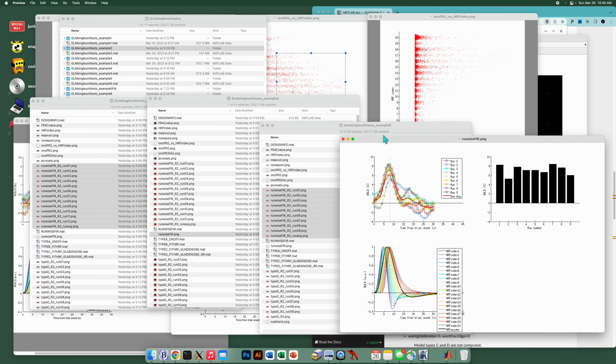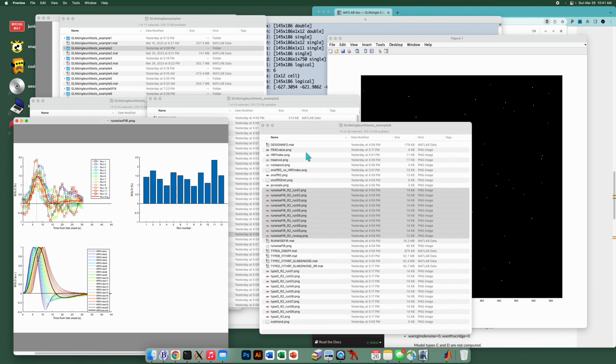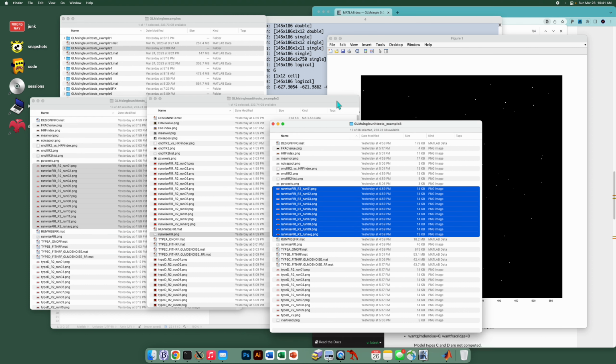Okay, so again, just to pop up a level, the Runwise FIR model doesn't affect anything that GLMsingle does. It's done as a very initial step just to help you diagnose and see any strange things happening in your data set, specifically with regards to time courses. This can be quite useful for figuring out what's going on if you see outputs that don't look great.